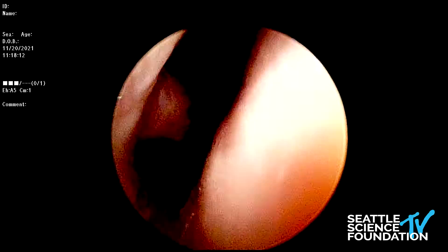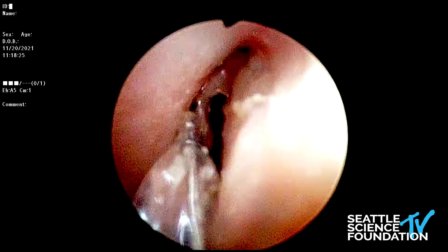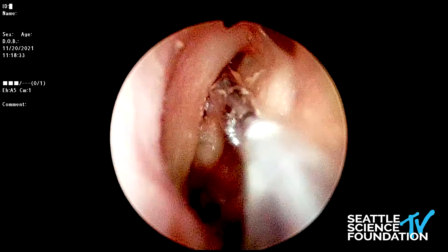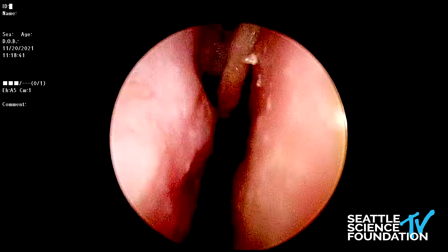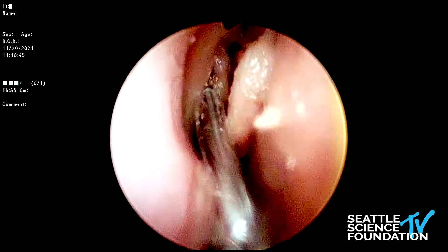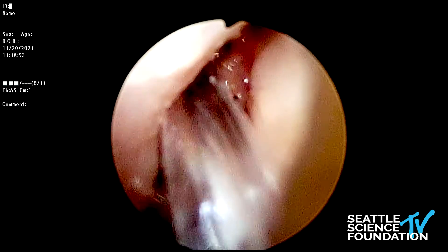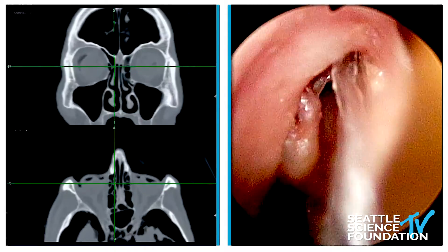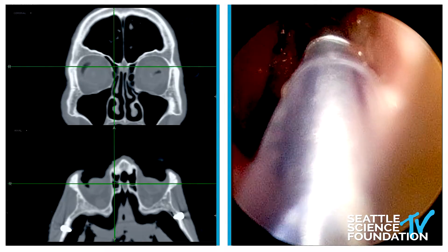Coming back — I don't know why we can't get this to navigate right here. It definitely helps to have a 30-degree endoscope. We have a zero-degree right now, and if I really drop my hand, you start to see where we're going to be. We're going to try a different one. We have this one here, and that's going to get us to the promised land. Looking at the sagittal — this is the most important view. Not the coronal, not the axial: the sagittal.